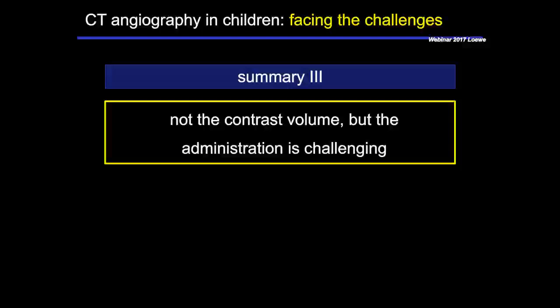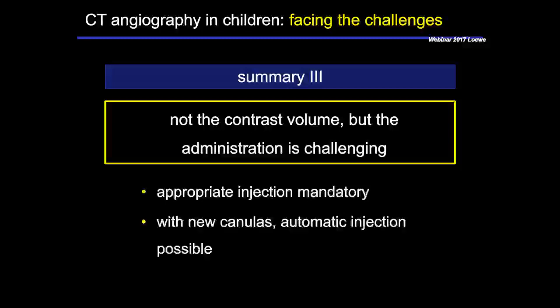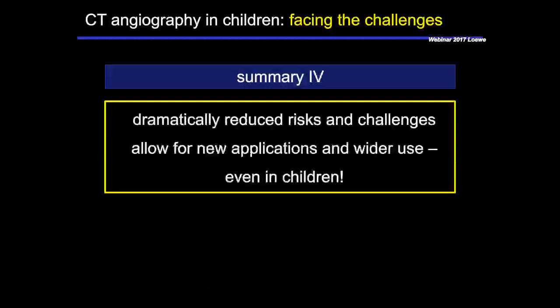These new venous cannulas can be really helpful because they allow for the application of the automatic injection in all circumstances. And never forget, never do a best guess technique. Please always go for the bolus triggering. It's a small amount of additional radiation dose, but it's really, really well invested. And by this, the risks and challenges in children could be dramatically reduced.